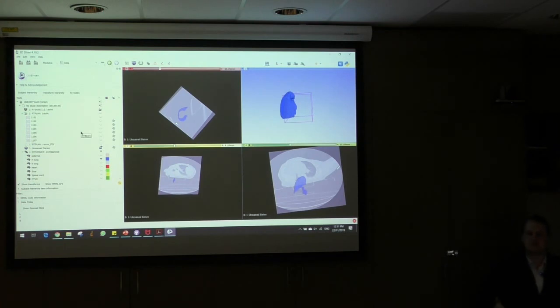You know, comparing plans against almost themselves, but you've got a similar image registration. Very interesting. Could you save that displacement field, for instance, and read it into the treatment planning software? Yeah, you apply a set of transformations to one particular data set, and you want to save that and then apply the exact same set of transformations to another data set. You can just save it and import that and apply it. I haven't done that. It would be very interesting to actually see if that would work, but that is not something that I've done.